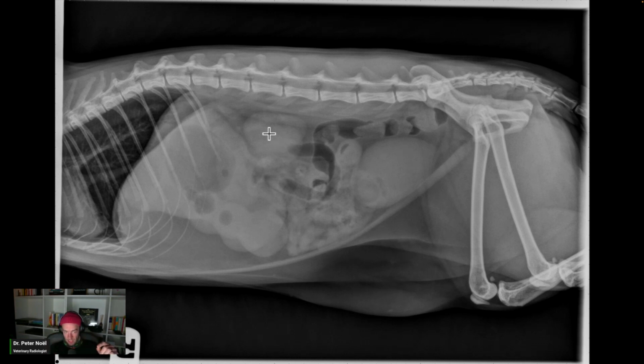If you ever see fluid, especially if it's anything approaching this volume of fluid in a cat, game on. You got to start looking. You got to look for an obstruction. And again, if the stomach is this distended, you should start thinking proximal, right? This is the pop-off valve. If you're going to convince yourself that the stomach is really this full of fluid, you got to think that there's some sort of obstruction. Foreign body, intussusception, tumor, an annular carcinoma will crunch down.